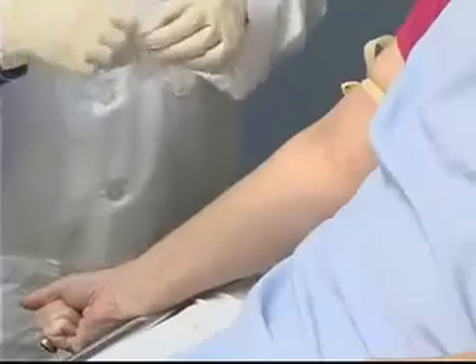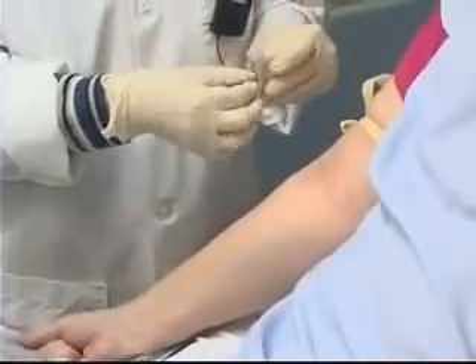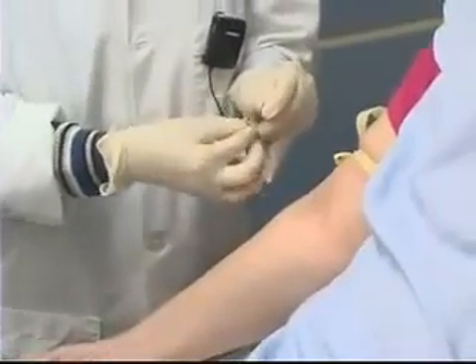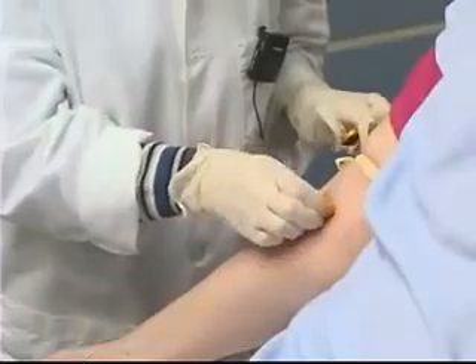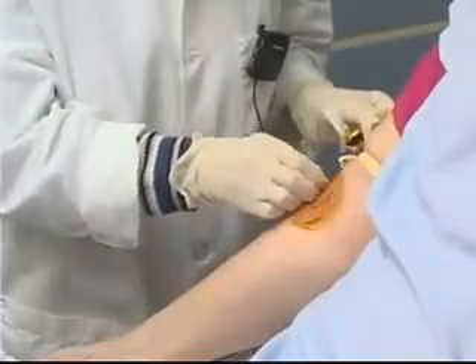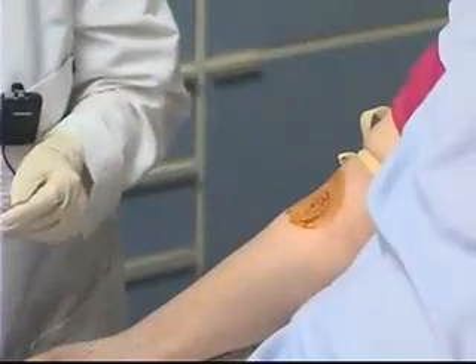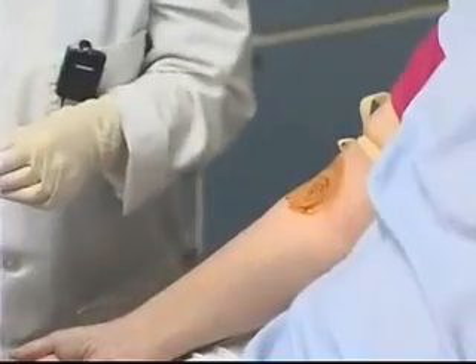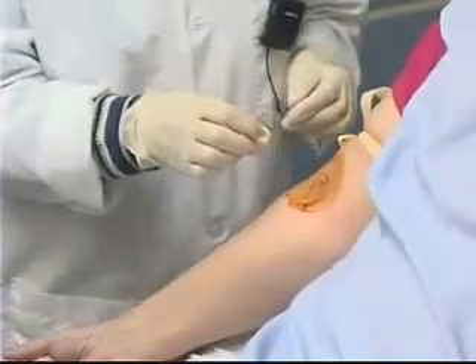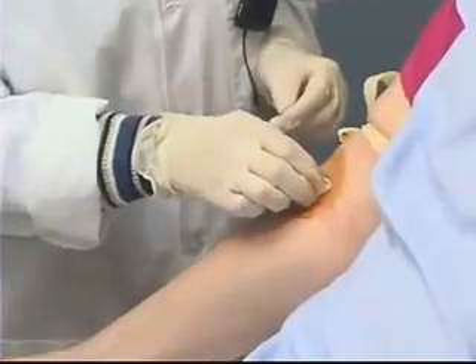I'll clean the area first with some povidone iodine solution, starting in the center and cleaning outwards in a circular motion. Allowing that to dry, I can then clean the area again from the center and working outward in a circular motion with an alcohol swab.